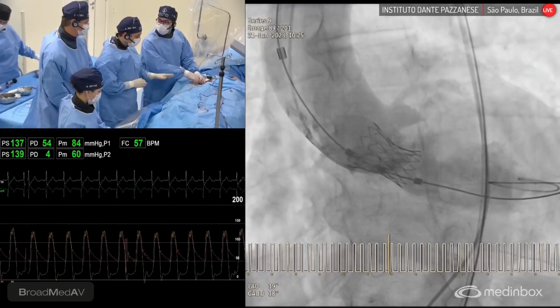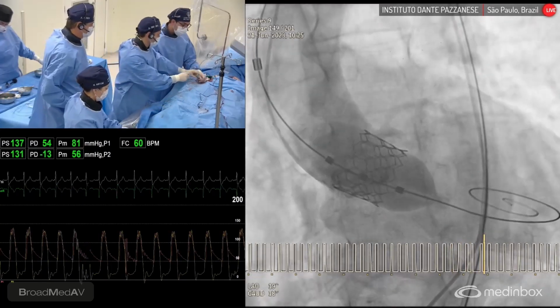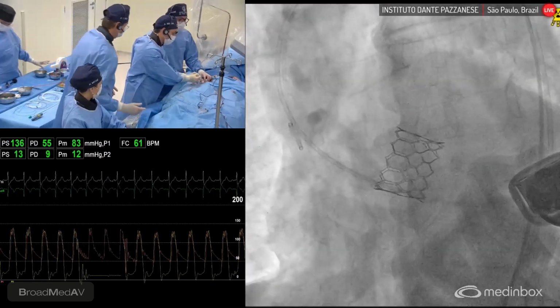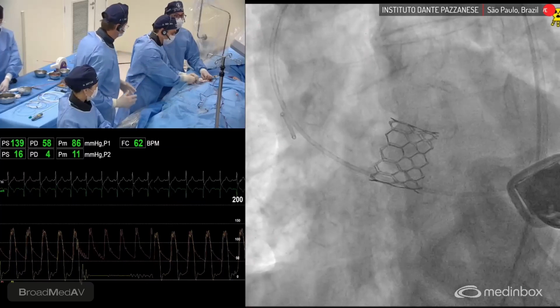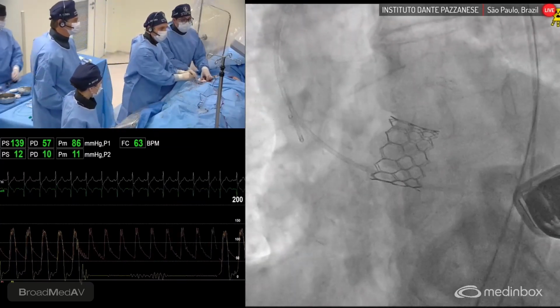Okay, good. Let's see the angio. Let's take off the pigtail. Are you going to do the angio? Because the patient has normal renal function, you're just not going to check. But you don't need it if you want. No, we don't need it, because you trust what Wendy showed us in the echo? Yes, sure. Okay, good. Thank you.